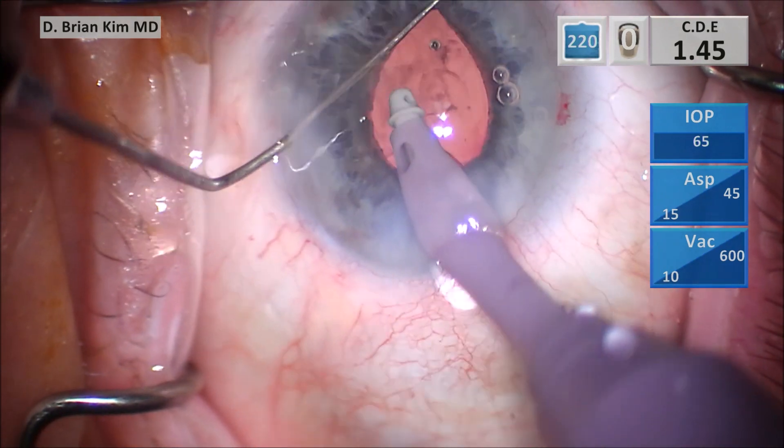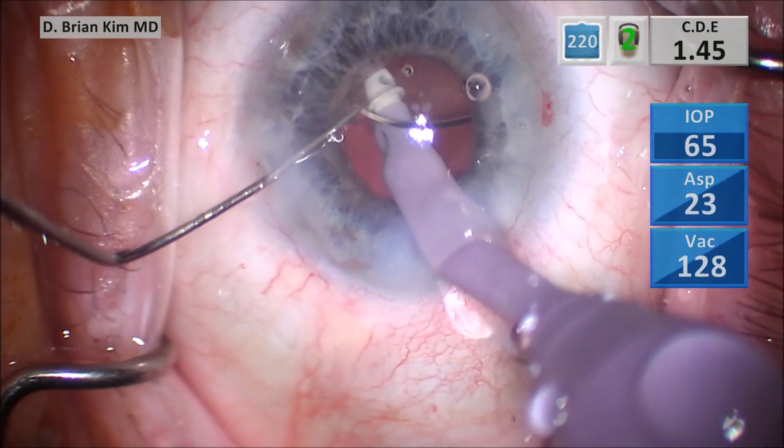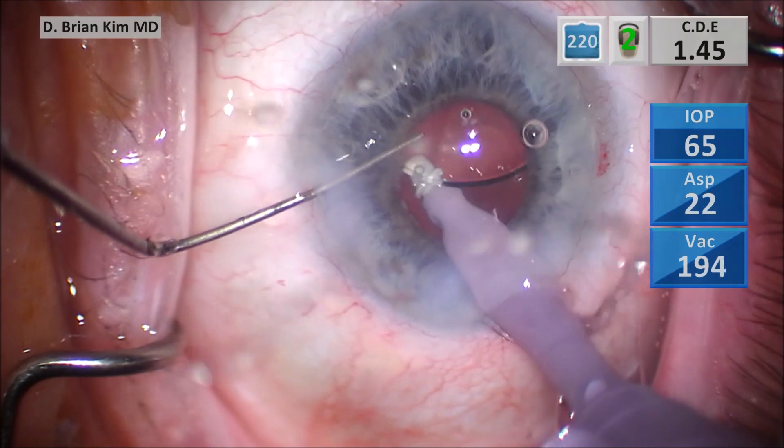I retract the pupil. I can tell the lens is clearly within the bag. I go underneath the lens, tilting it and rotating it 90 degrees with the help of the Maltzman, and by doing so I'm ensuring that the trailing haptic is also within the bag.